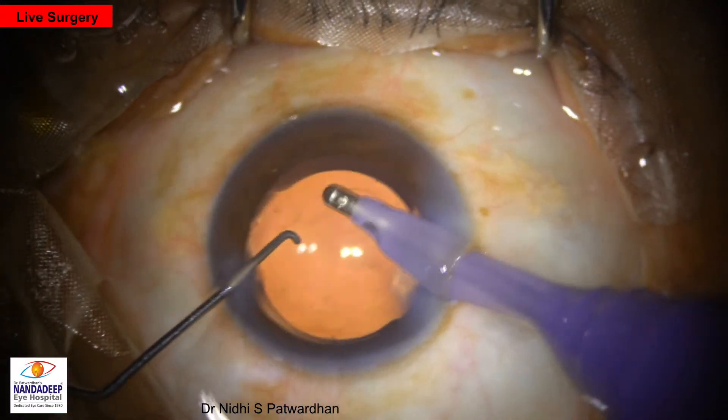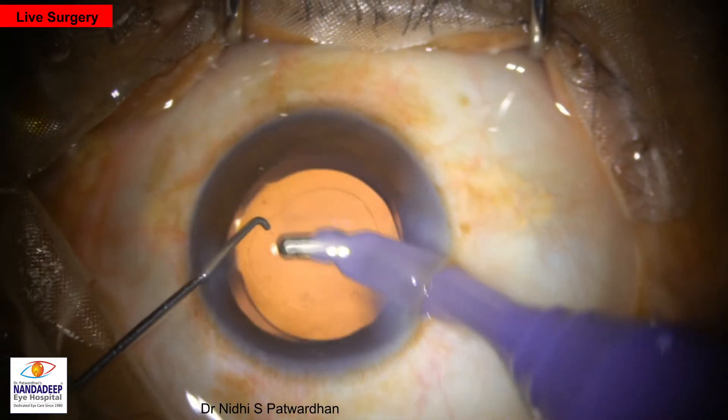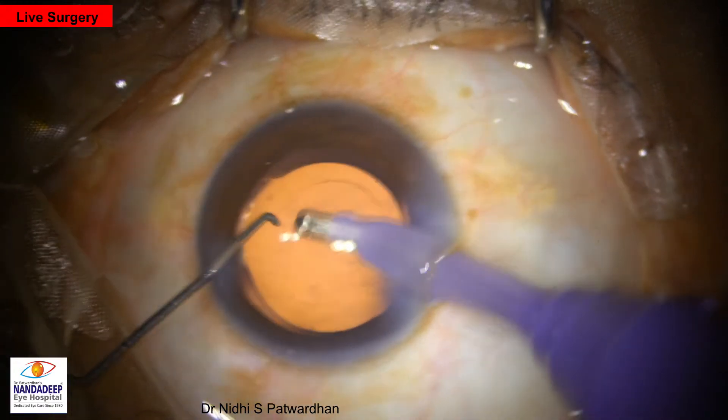CCC is good and covering the optic. We expect a good and predictable outcome.